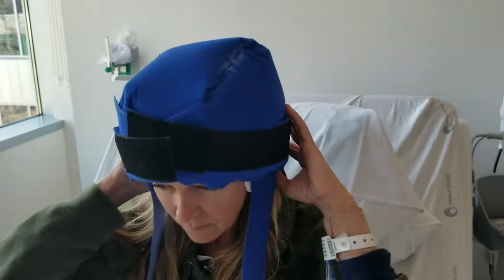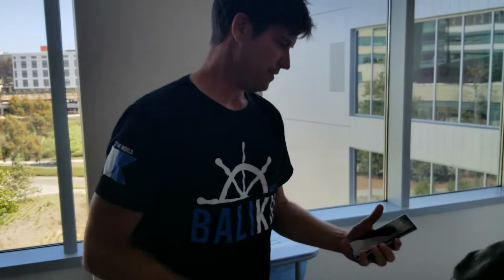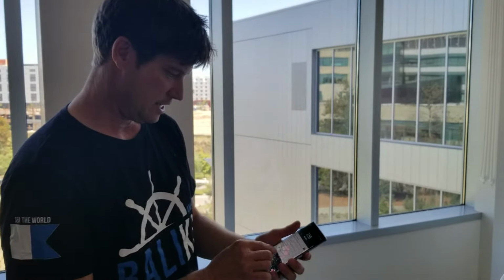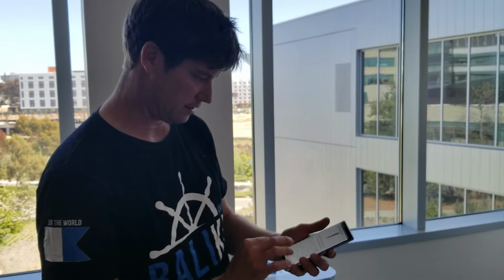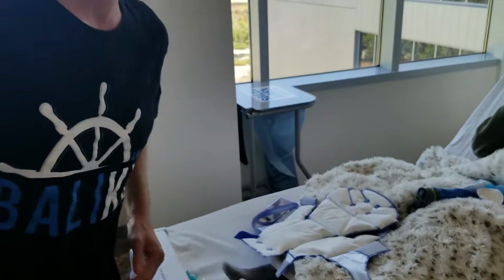I come over here, and I set up a bunch of alarms. Initially I set up like 50 alarms based on the Excel spreadsheet that they send over to you and tell you when to take caps out and take caps in. So I just come over here and set the alarm clock to about 27 minutes. That gives me enough time to take one out and get ready for the next change out, which is right around 25 minutes is what you really want to do. So now I've got the cap, and let me show you a couple other things.